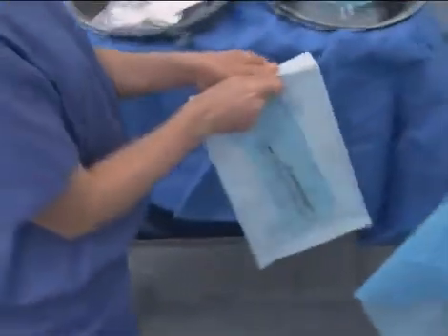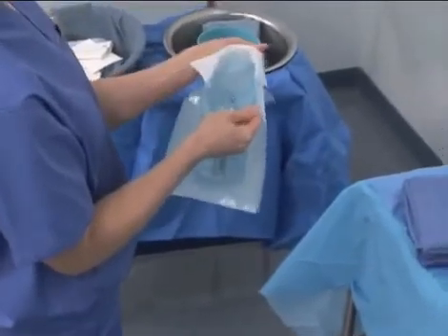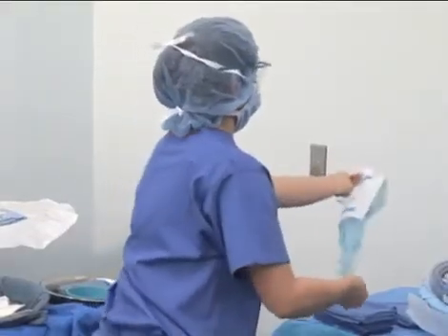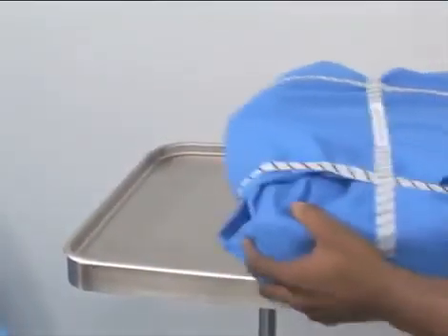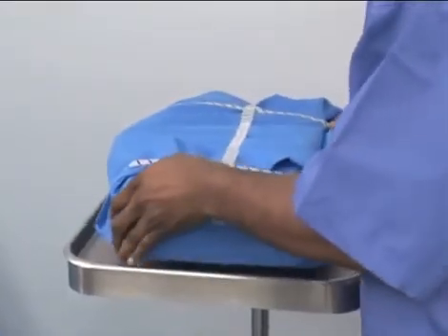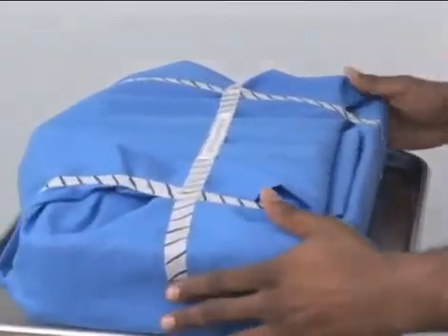Packages wrapped in sealed pouches may contain an inner wrapper. Open the outer pouch and distribute the item with its inner wrapper intact. Never unwrap a heavy item while holding it in midair. Instead, place the item on a small table and remove the wrapper using aseptic technique.